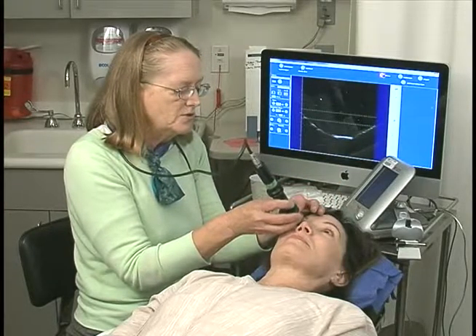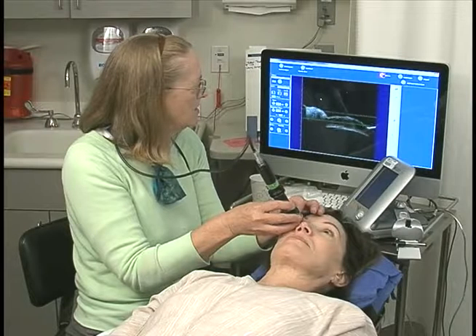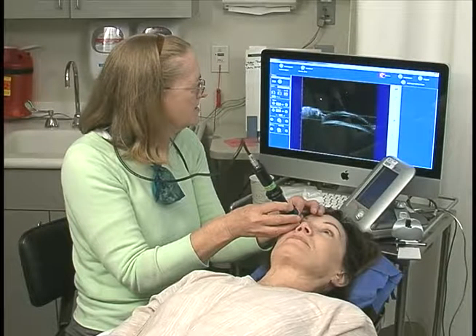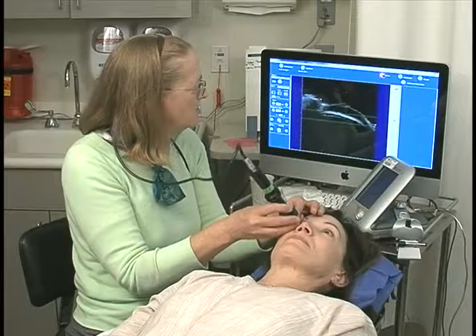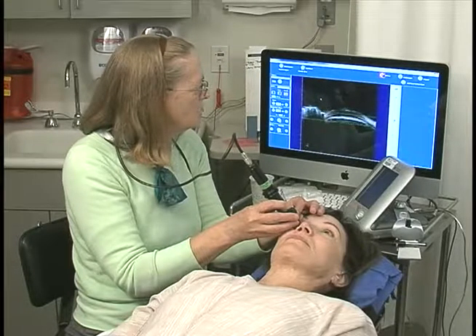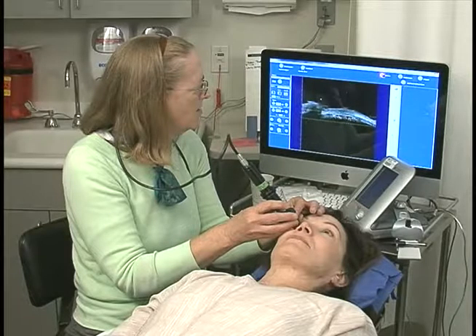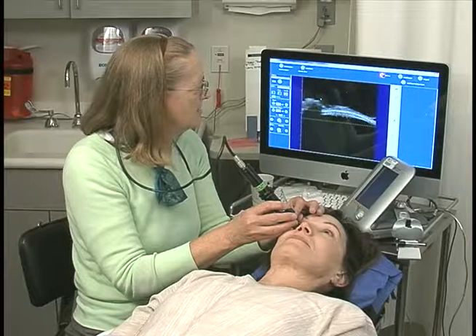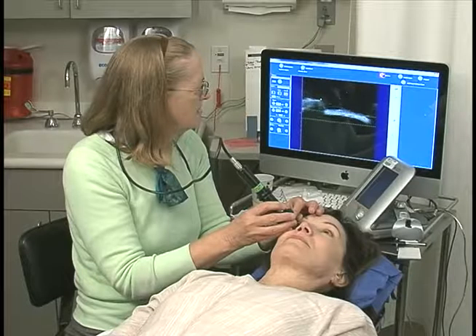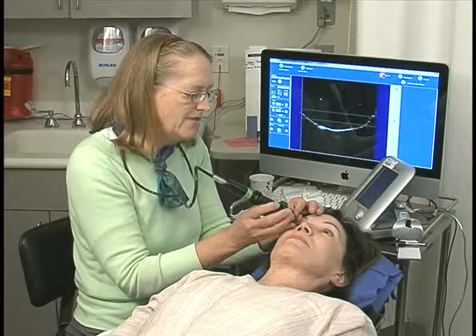So I'm going to do sort of an axial-type image, where you can see the cornea and the iris, and now what I'm going to do is start sweeping out. And you see it get narrower, more narrow, and there are the ciliary processes — more ciliary processes — until I go way off to the sclera.